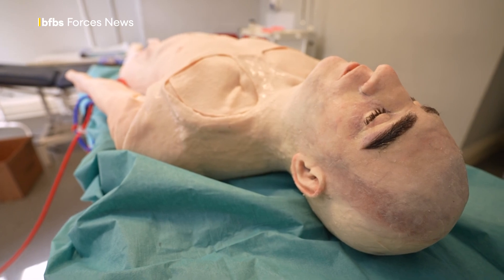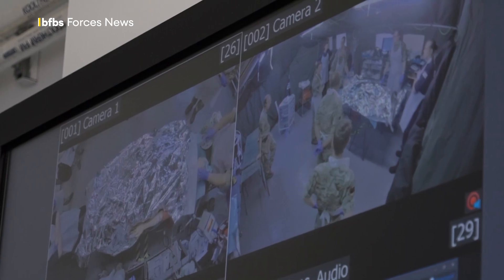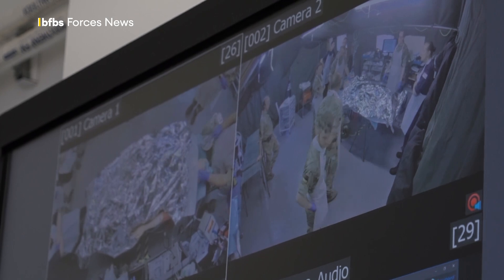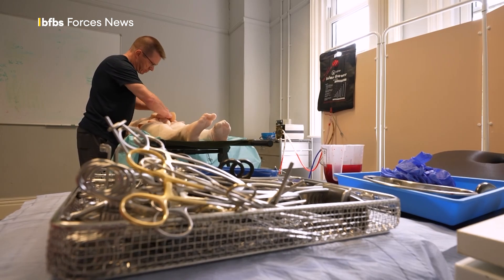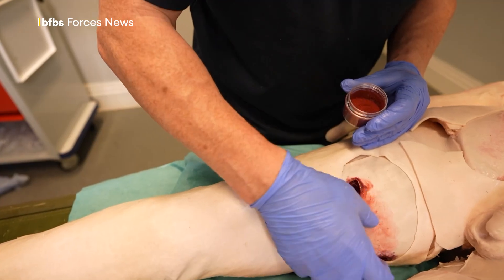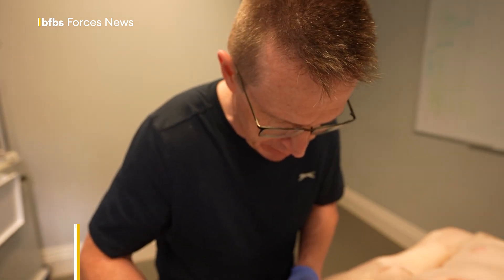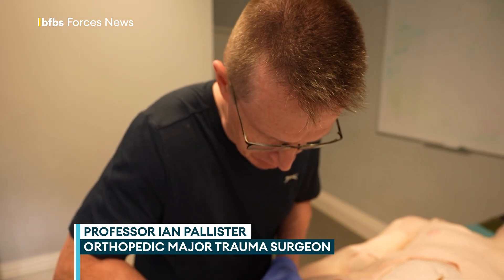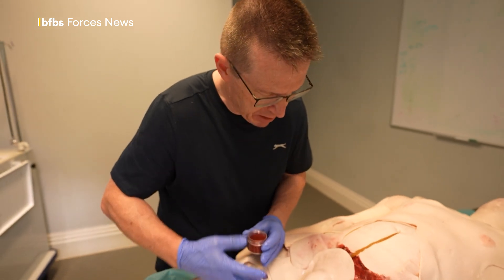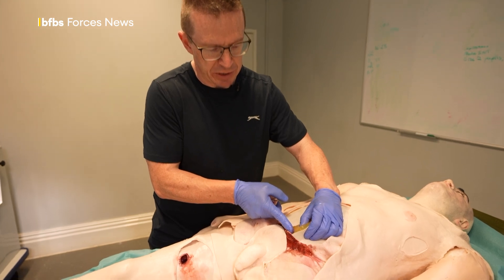Previously a scenario would stop when the patient reached the point of surgery and the surgeon would talk through what they'd do next. Now they can actually do it. He was created by orthopaedic major trauma surgeon Professor Ian Pallister. The model, apart from resin for the bones, is essentially different types of silicon, including very elastic silicon for where the skin is.